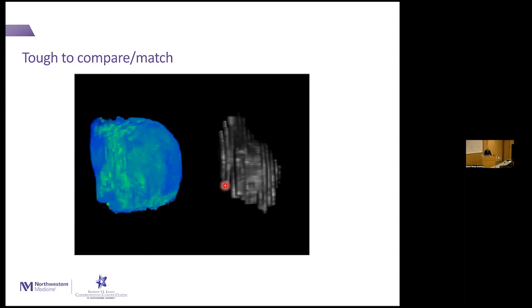You can see the bottom of the prostate is sloped compared to the ex vivo one. That's from the endorectal coil, and then it's sloped up here from the bladder pushing down. Let's not worry about the video.